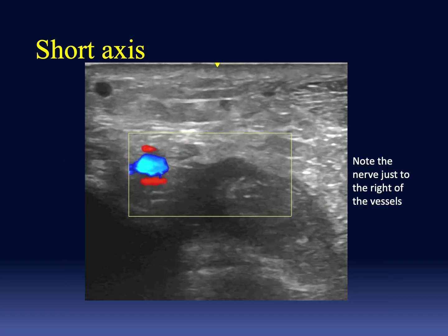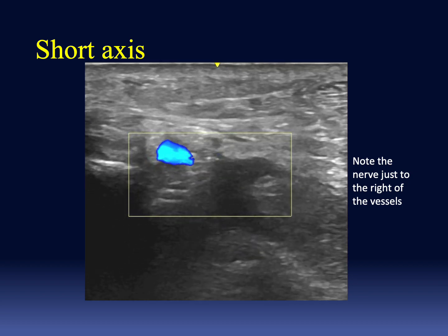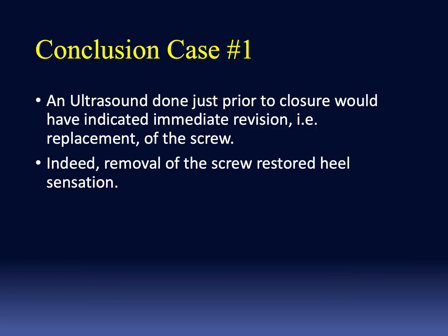If we go short axis with our Doppler view, we can see that the screw actually passes underneath the artery, and it is the posterior tibial nerve behind the artery that is resting on the tip of the screw. So the conclusion that we can draw from this is that an ultrasound done just prior to closure would have indicated an immediate revision, in this case a replacement with a shorter screw. And our diagnosis was confirmed: in the post-op period, sensation was restored to his heel.